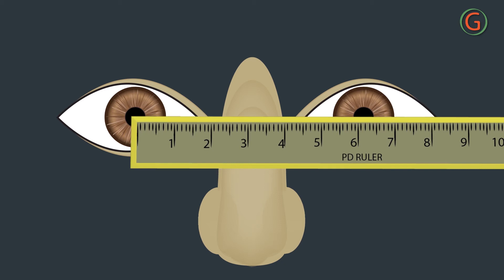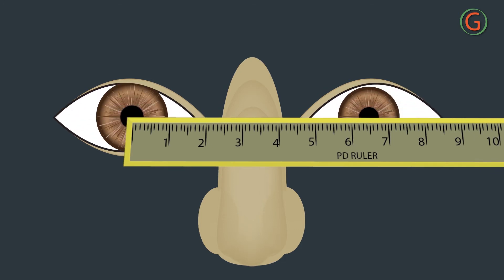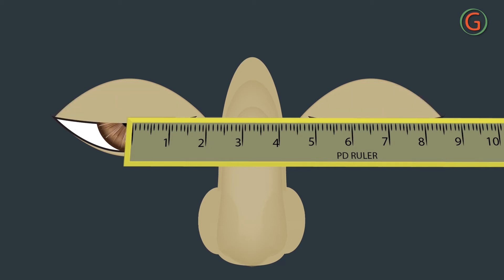The PD ruler should be positioned across the subject's nose with the measuring edge tilted back, so that it rests on the recessed part of the nose. The dispenser steadies the hand holding the PD ruler between the thumb and forefinger, with the remaining three fingers resting on the subject's forehead.